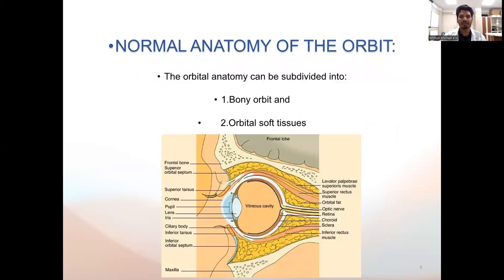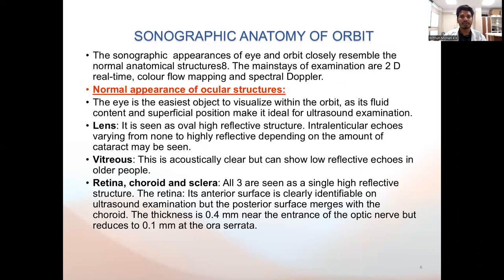This image shows normal anatomy of the orbit, which includes the bony orbit and the orbital soft tissues. The sonographic anatomy of the orbit: the eye is the easiest object to visualize within the orbit as its fluid content and superficial position make it ideal for ultrasound examination. The lens is visualized as an oval high-reflective structure with intralenticular echoes varying from none to highly reflective, depending upon the amount of cataract present. Vitreous is acoustically clear but can show low-reflective echoes in older people. Retina, choroid and sclera are seen as a single high-reflective structure.